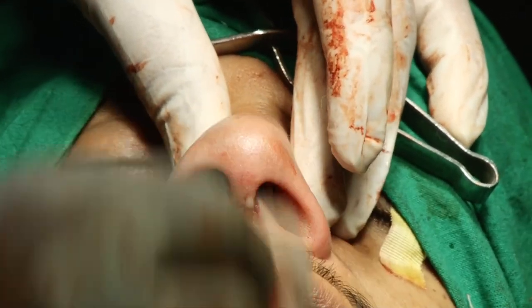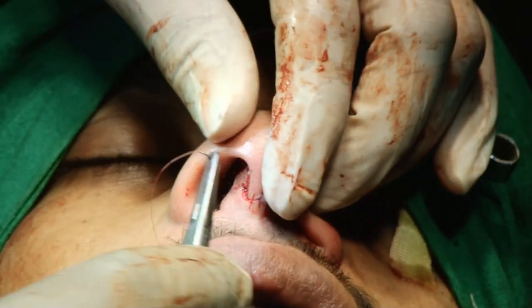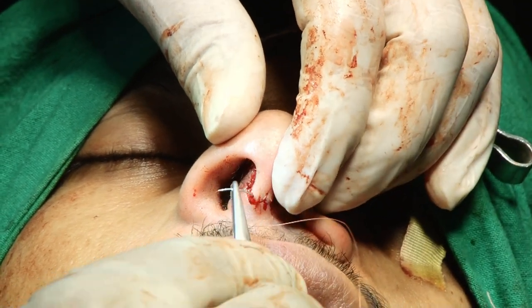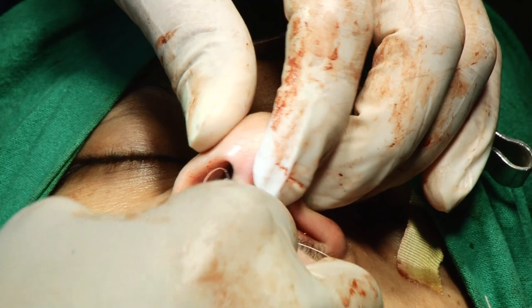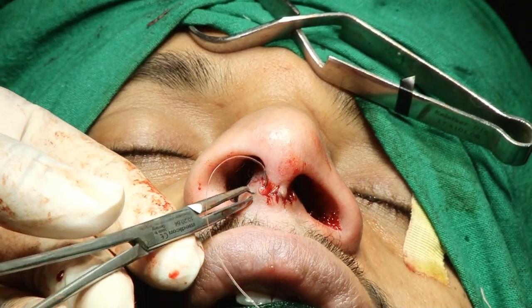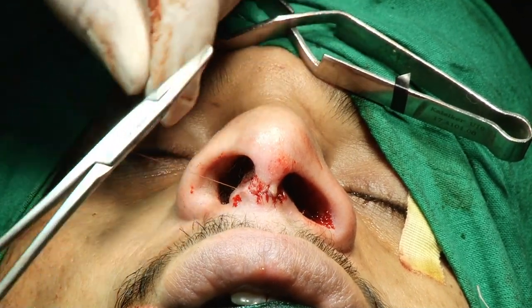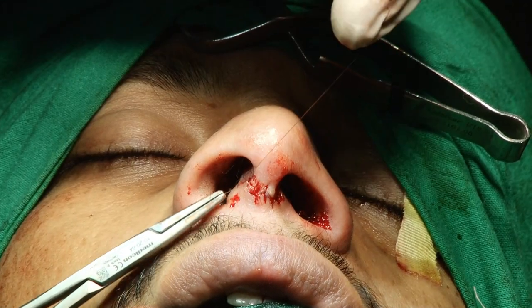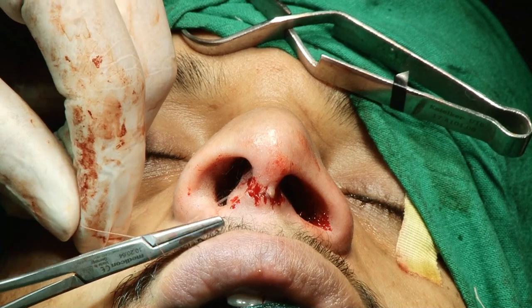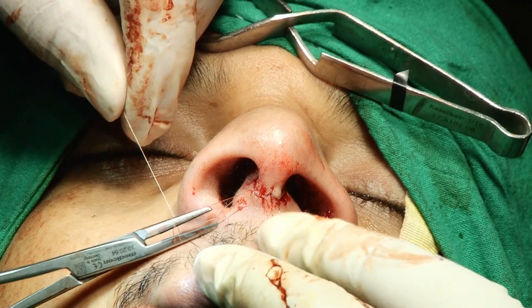6-0 Vicryl Rapid sutures, sir. It just makes life much easier because you don't have to remove the sutures, and we've done quite a lot of work looking at the scars, and it really makes no difference to the scars in the long term. The only slight downside is a little bit of redness for 2 or 3 weeks, whereas you might not have that with the nylon suture. It's much nicer for the patient not to have to remove all these stitches.